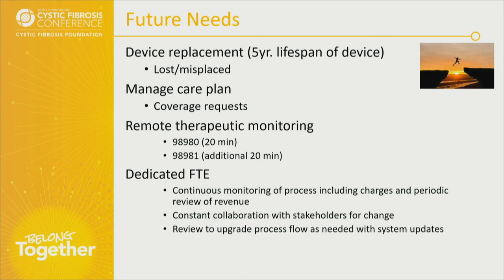I also asked about people who have lost devices. Because we have had a few, and I said, do we get a discount because we have a contract through the foundation, and we started this when it was initially started, and they said, you do. So this is new. So this is late breaking. It is $99 for someone to replace their home spirometry if they were a previous user, meaning they were on the dashboard, but now they've lost it or have used the device at least once within the time that they had it dispensed.